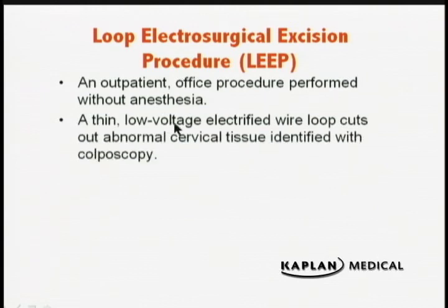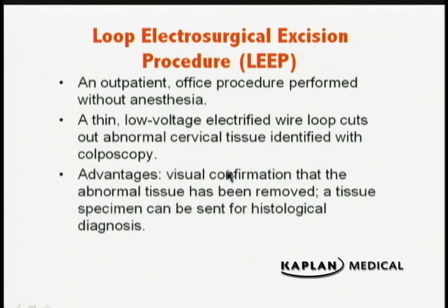A thin, low-voltage electrified wire loop cuts out abnormal cervical tissue identified with colposcopy. So you see these abnormal areas, and you can then resect them and send them to pathology using the LEEP. The advantage, when you see an abnormal area, you can confirm visually that the abnormal tissue is gone.